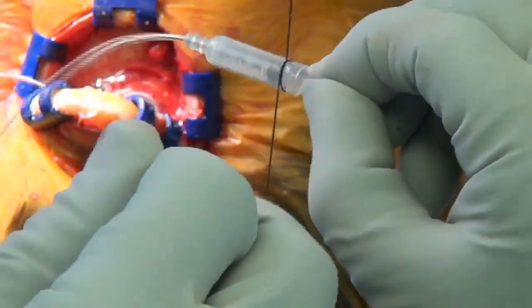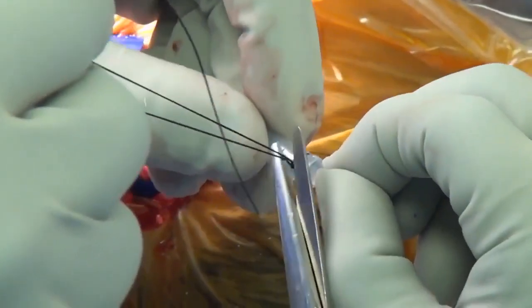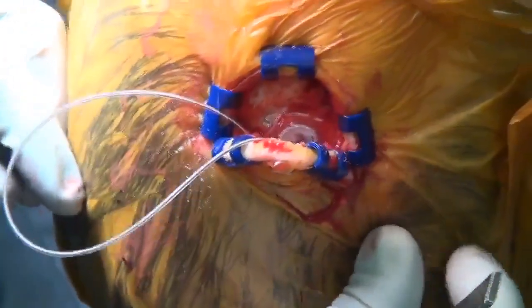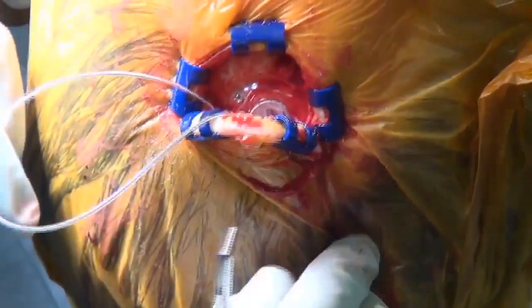So I'm just securing this in place. Okay, that's it. Bayonet. So now I'm tucking this above and toward the back of the ear, in preparation for next time, so I can manipulate it back here.